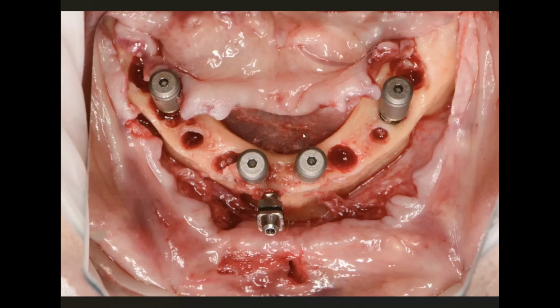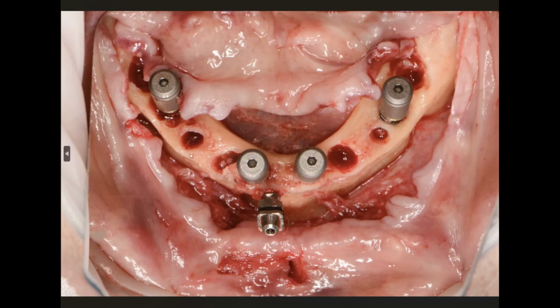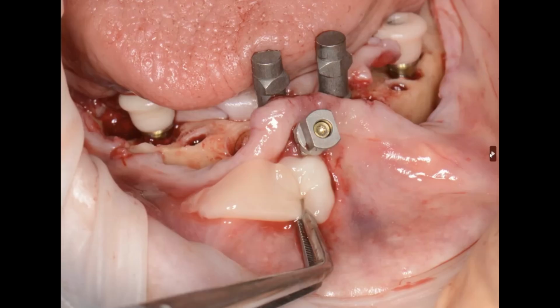I'm a little out of order, but this is us showing photogrammetry. We're using Micron Mapper in the surgery room. So this is their newer scan bodies, the 2-piece scan bodies. So we are using Micron Mapper here, and we do that. And then we're ready to close. I've got my PRF ready to go on the table. And then let's go back to that soft tissue.